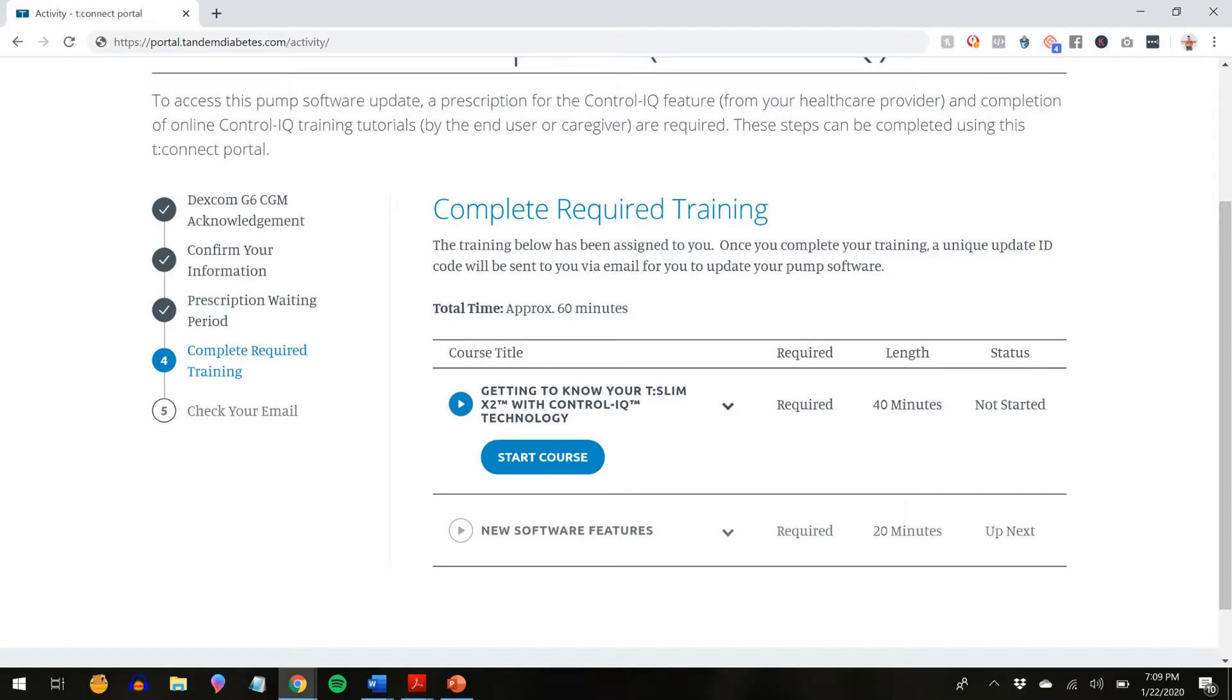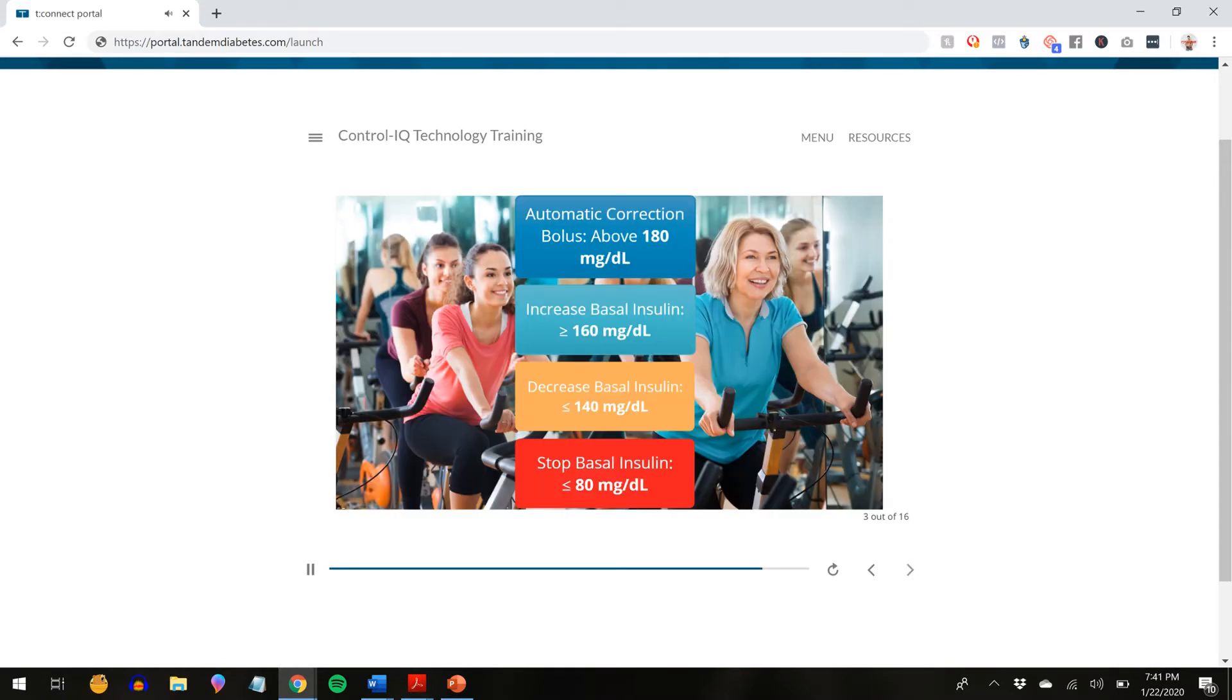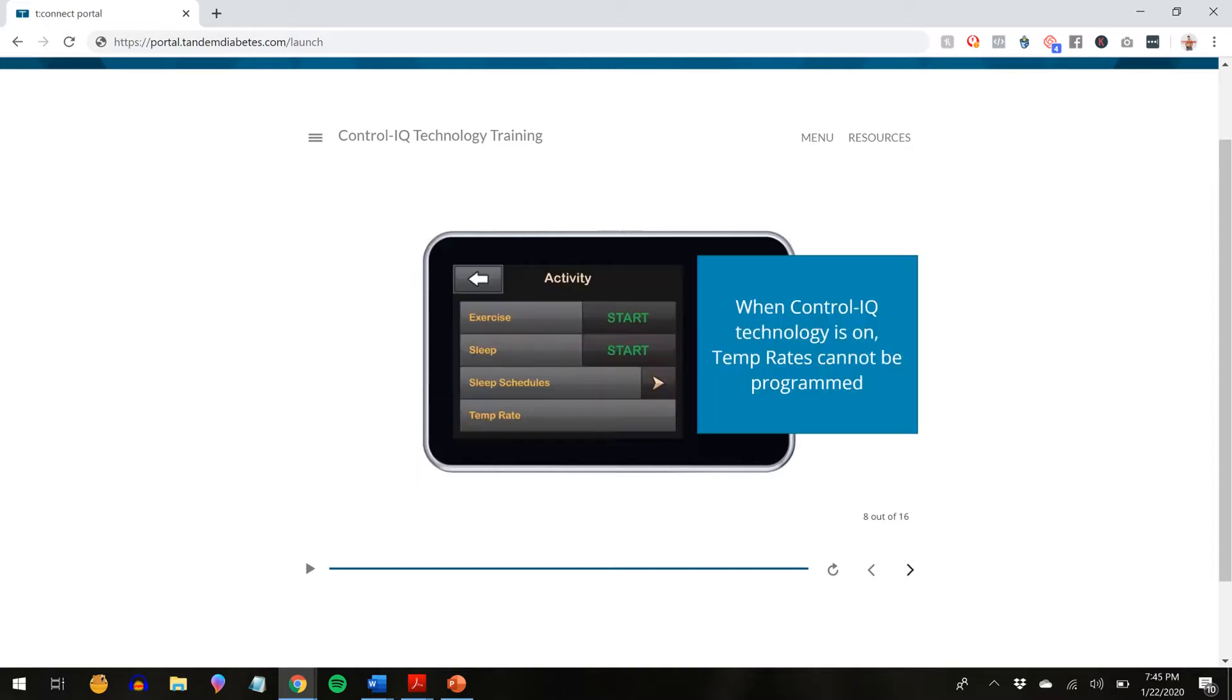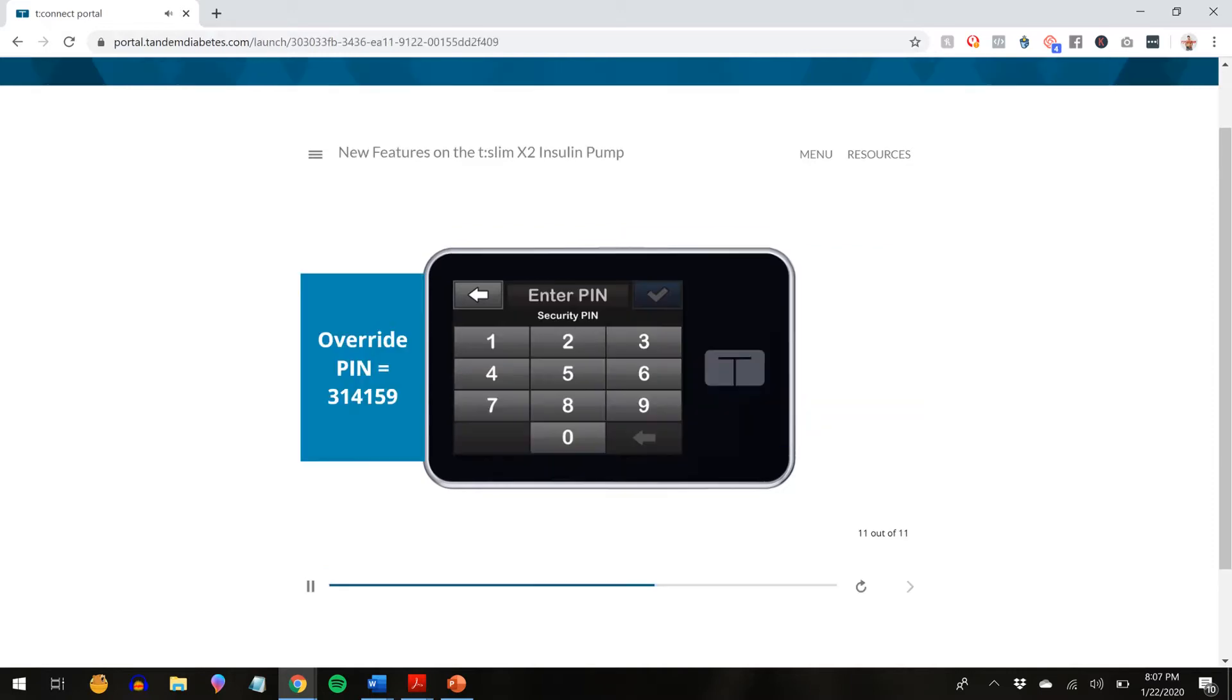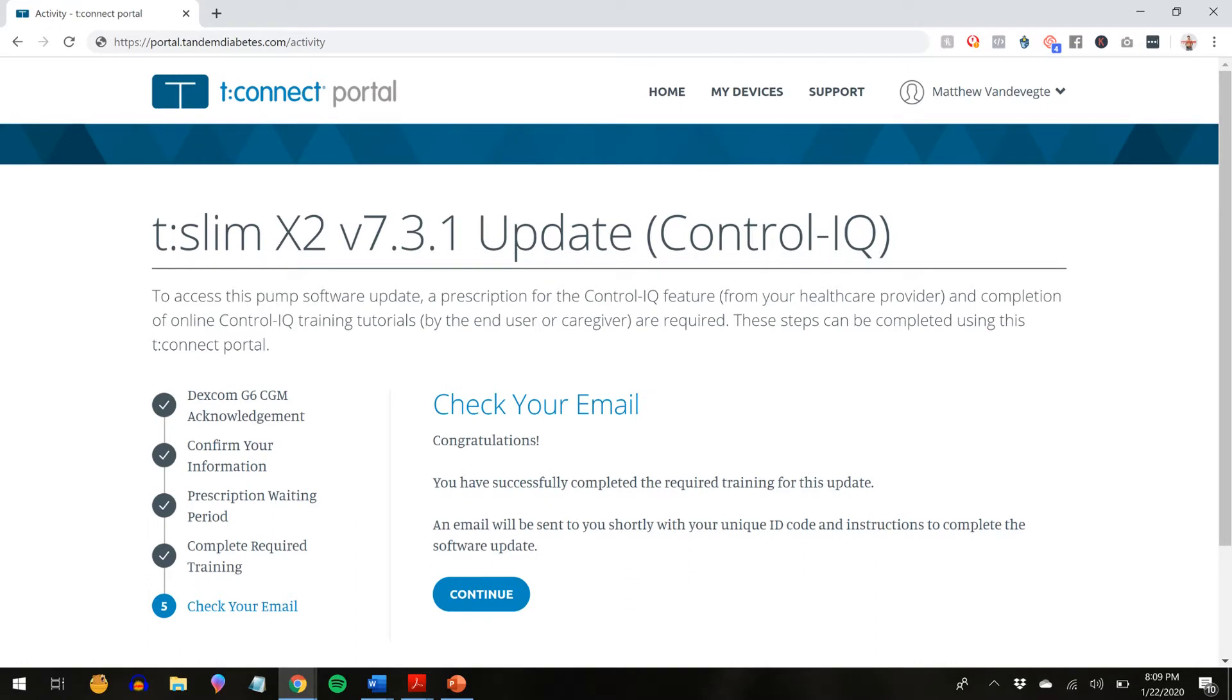All right, so here we go. All right, guys, so once you get an email, you click on the link. It'll take you to this page where you can start the process. Control IQ aims to keep you between 70 and 180, which is amazing, and these are kind of the slides you're going to learn about the exercise settings specifically here. The next one's going to be sleep settings, which is different than your normal settings. Know the difference for your quiz, but also for real life. Control IQ, when it's on, you cannot use temp basal rates, which is interesting. I didn't know that at first, and of course, if you set a pin code, this is your override in case you forget your pin, so don't lose that override code. Once you pass your quizzes with 100%, you'll be allowed to continue on and get that update, which is super cool.